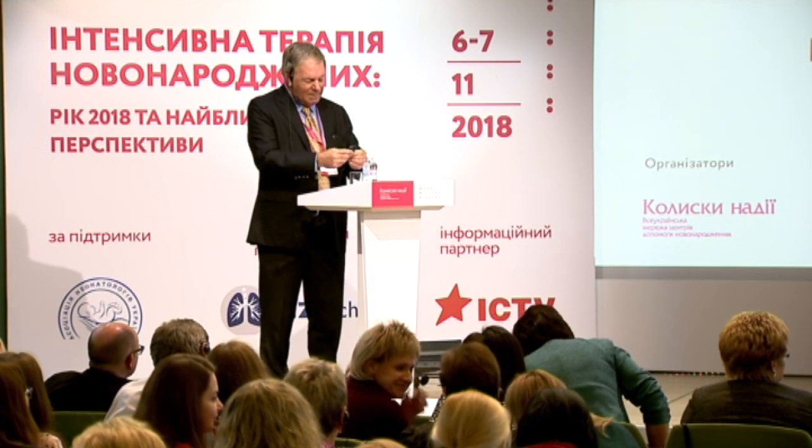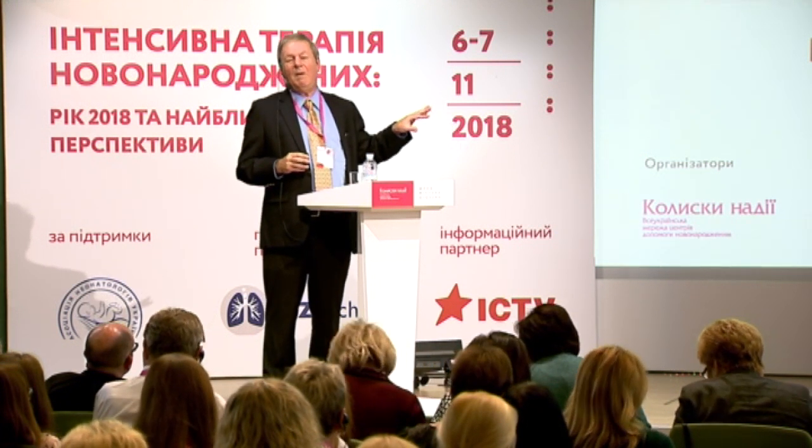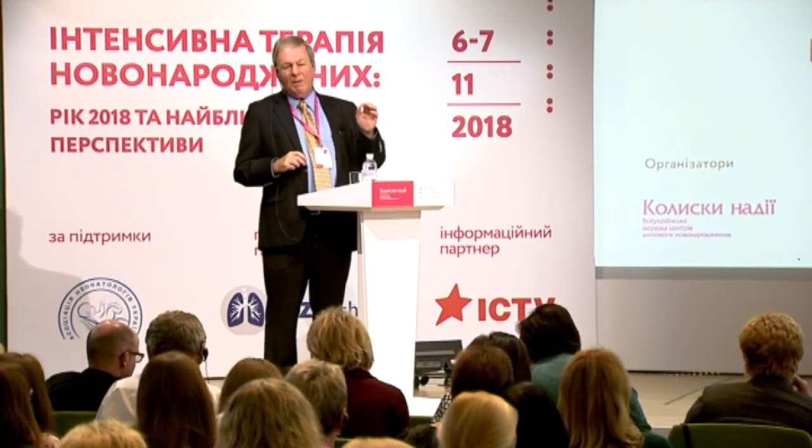Well, I think you're right that some of this really depends upon having an information level that guides your thinking. And if you're using an older generation IMV machine, the principles are still there. It may take you a little bit longer because you don't have the data at your fingertips.